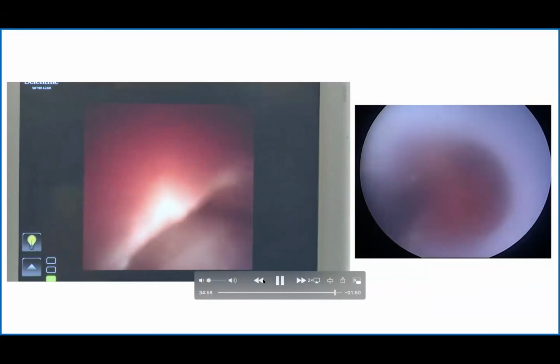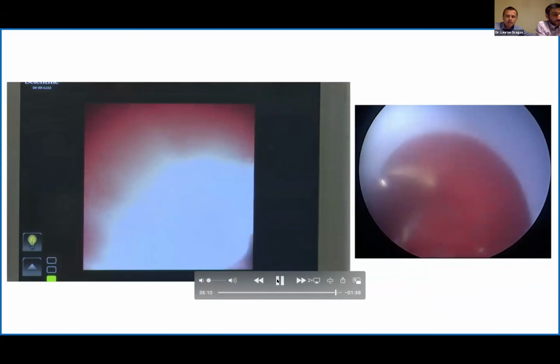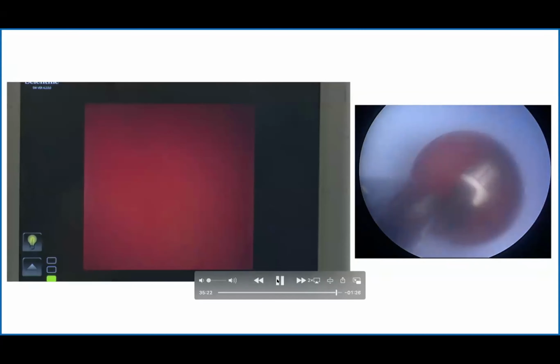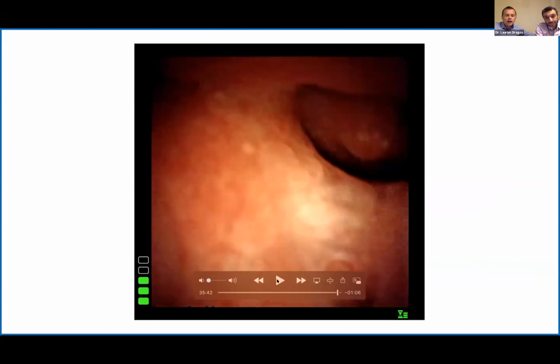Just on the question of fornix rupture, there's a question that's come through about the pressure, because obviously you're talking about the SAPs, and the SAPs can generate a significant amount of pressure, particularly if you use it during flexible ureteroscopy. So how do you judge how much pressure to use, or do you think that in a PCNL, when you've got an open system like you have here, it's not such a concern? I think you've answered the question, at least part of it.